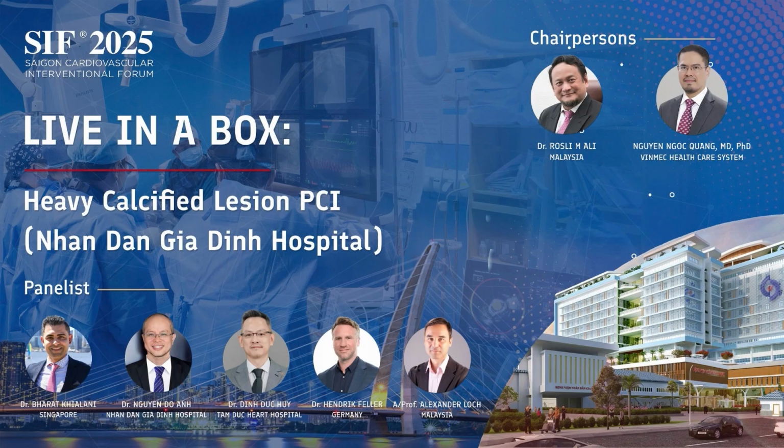Regarding the first question, I'm very comfortable with IVUS, but both tools work, OCT or IVUS for sure. Given the very large amount of calcium distributed from the left main to the mid or distal LAD, I think IVL would be a good tool, but you need several balloon sizes. Same as Rota, no one burr size would work here. So if I could choose from all the tools, I would go with orbital, low speed in the mid to proximal LAD, and then high speed in the ostial and left main.